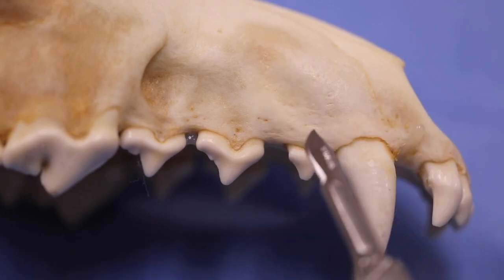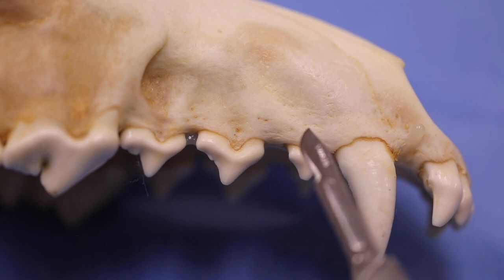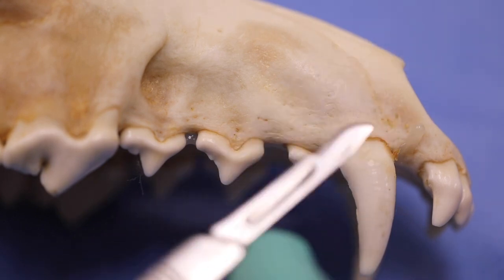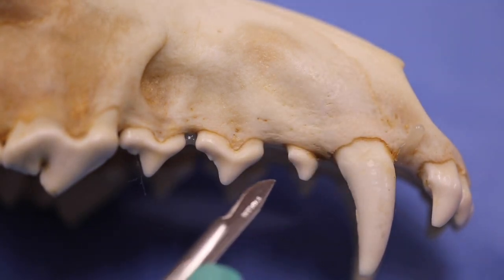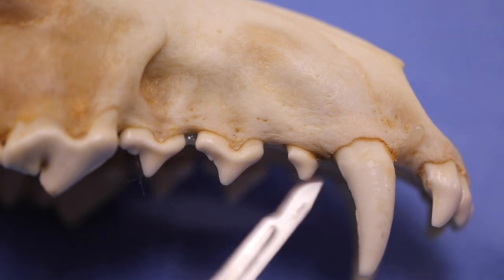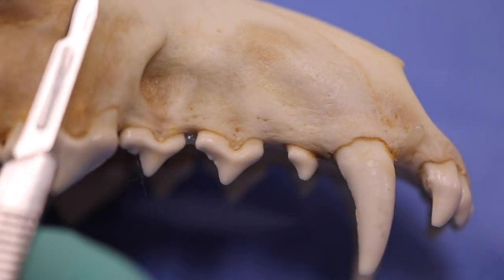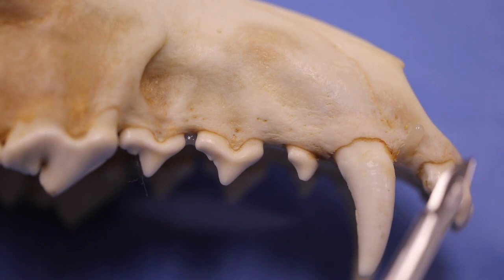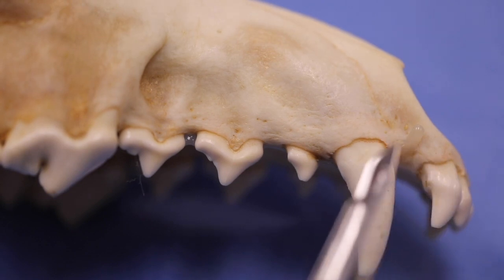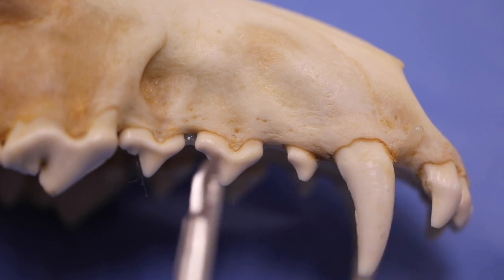When we're approaching incisions in dentistry for mucoperiosteal flaps, it's a lot different than it is in general practice for our normal incisions. Usually what we're doing is a continuous incision for, say, a laparotomy — it's more like this. In dentistry, we've got this real thin mucoperiosteal flap that we're trying to elevate off of the bone, and it's very easy to disrupt that. So what we want to do is use the scalpel in stab incisions instead of continuous incisions.